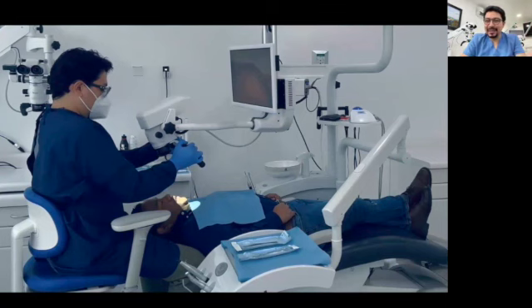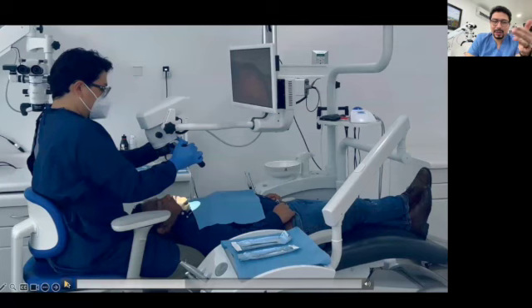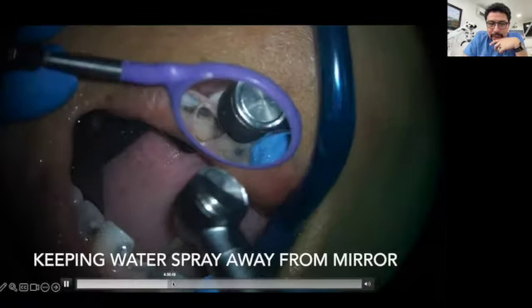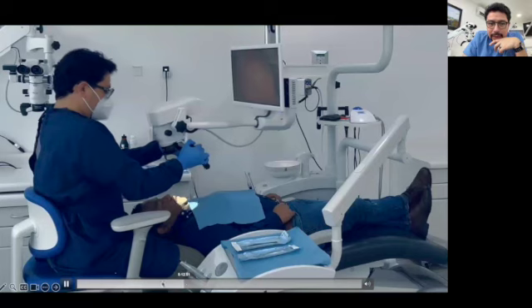That is the position that you need on the patient. They need to take down the chin and the position of the head of the microscope when you want to have a direct vision in a lower molar. It's comfortable, but sometimes it's needed to use the mirror as well, depending on what you are doing and what you want to see inside of the tooth, often to check the progress of the preparation.